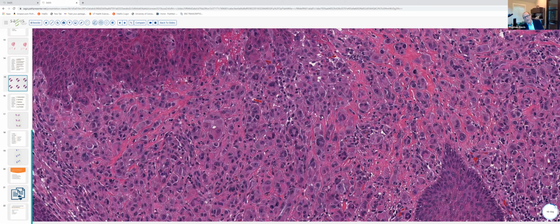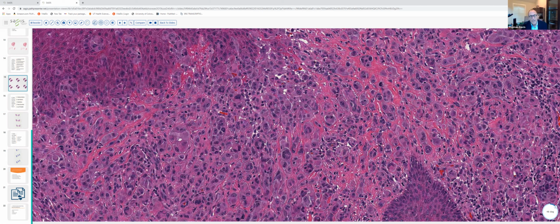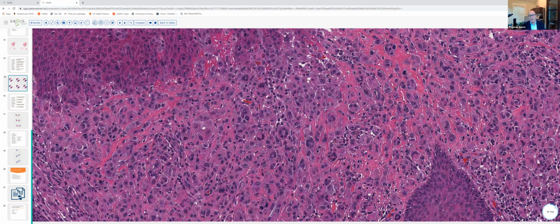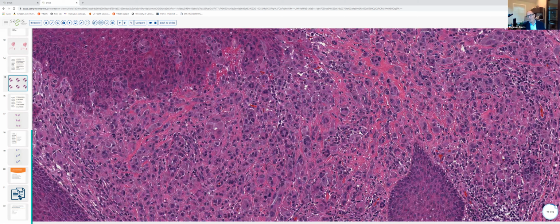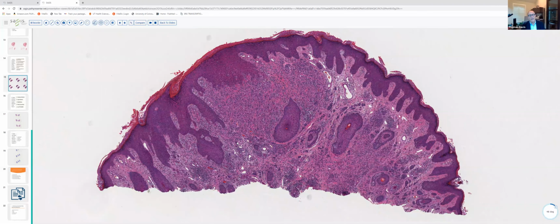And these are very epithelioid melanocytes, similar to what you see in a Spitz nevus. And so you might consider here some type of combined melanocytic nevus with a banal and a Spitz component. And when you see an epithelioid proliferation of melanocytes plopped down in the middle of an otherwise banal appearing lesion such as this, and there's no significant atypia, you want to think about the possibility of a BAP1 inactivated melanocytic tumor.